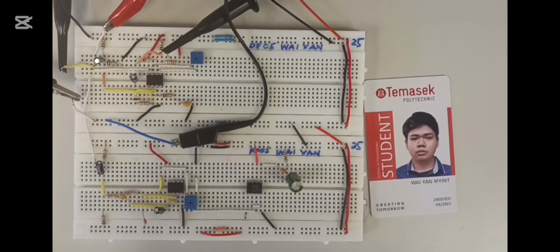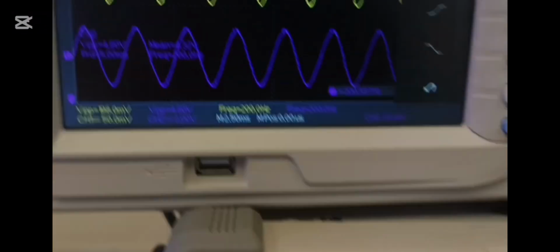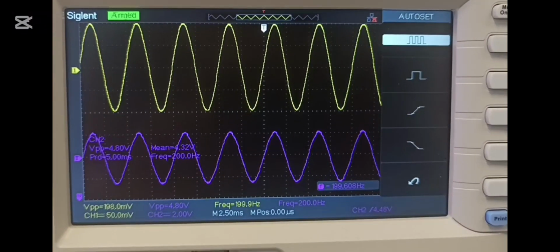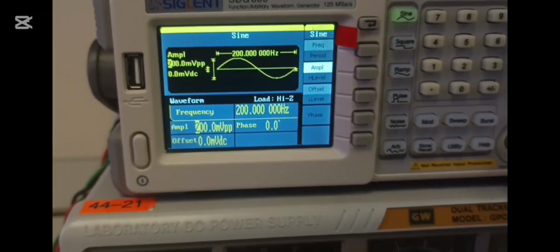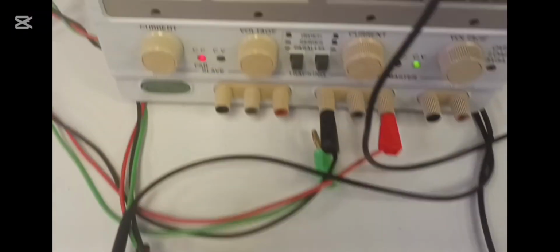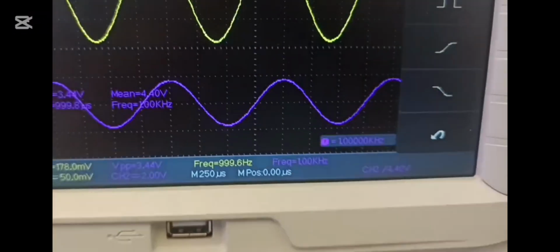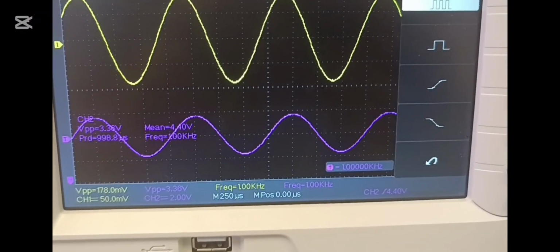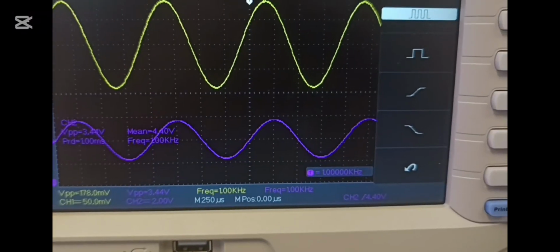Here in this video, I connect my probe to test point 2, and then I set my function generator at 200 millivolt and 200 Hz. Then I got an output voltage of 4.8 volt. And when I change my function generator to 1 kilohertz, my voltage dropped to 3.36 volt, or 3.44 volt.